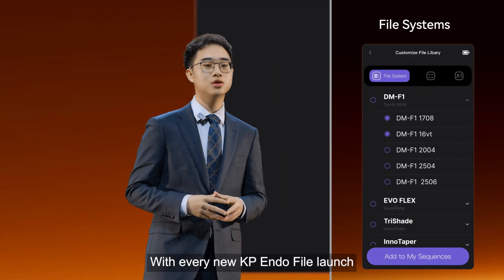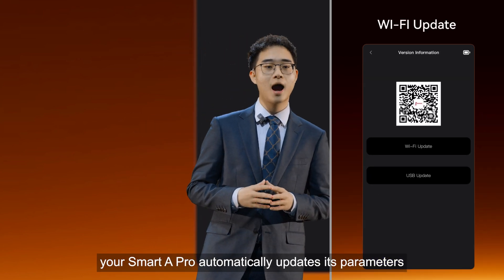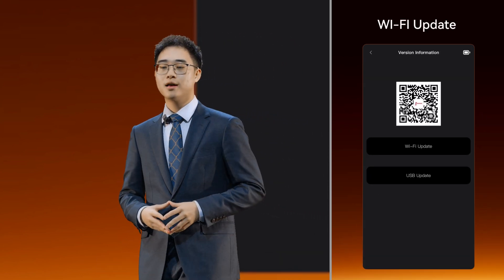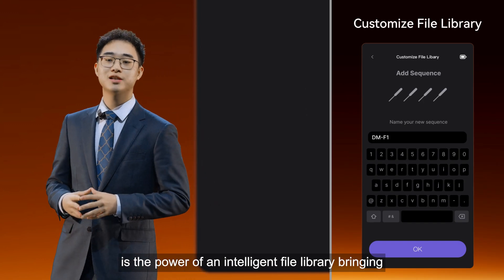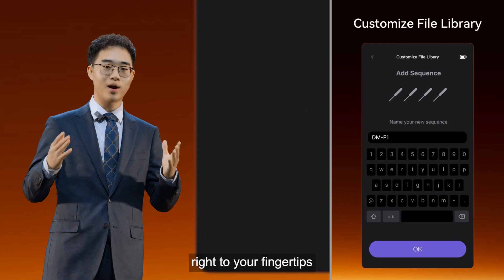With every new KP Endo file, your Smart A Pro automatically updates its parameters. This is the power of an intelligent file library, bringing the world's latest innovations right to your fingertips.